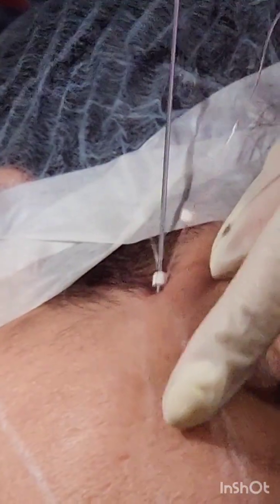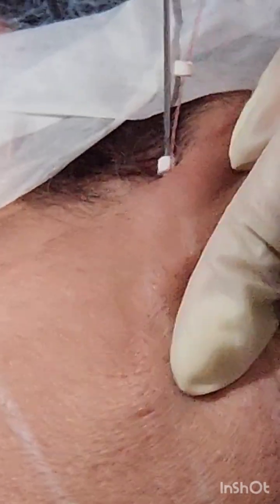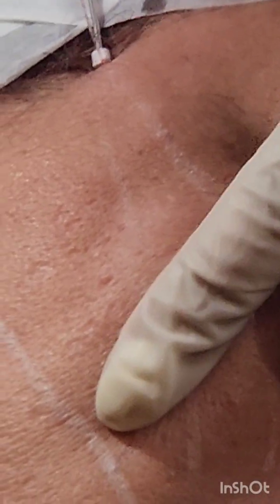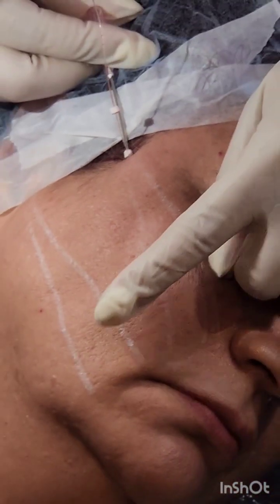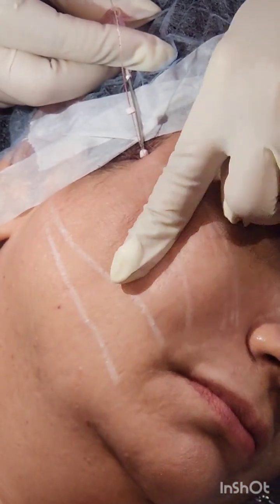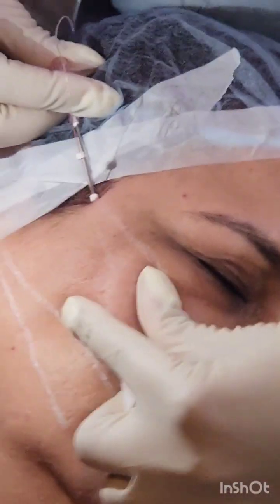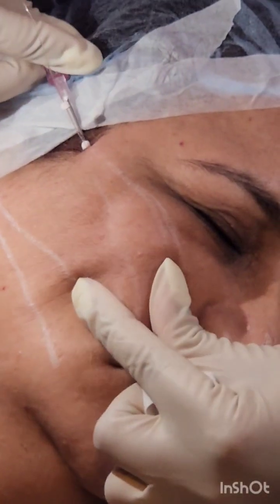Okay, now these are my vectors. I'm advancing, I'm lifting, I'm advancing. Always maneuver the skin over the needle, okay? Right hand will put pressure, the left hand will maneuver the skin, like how you do when you are sewing. I don't know how many of you sew these days, but yeah.